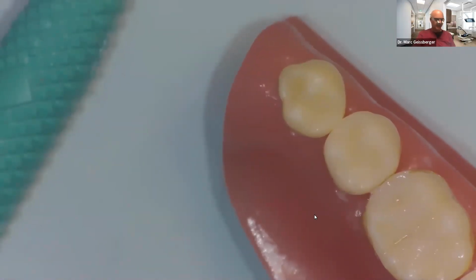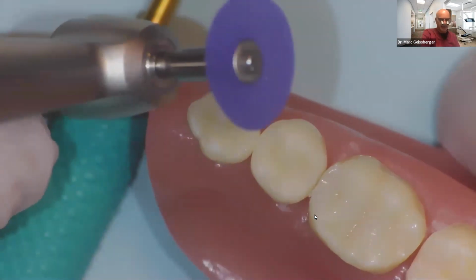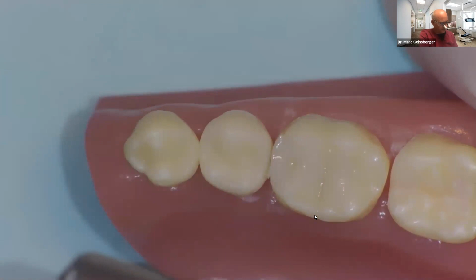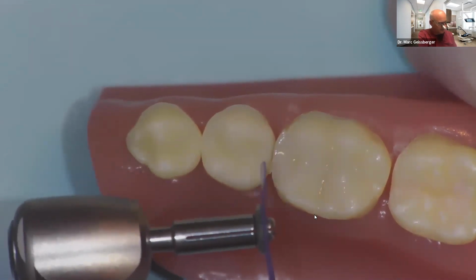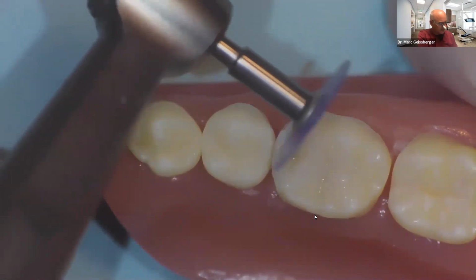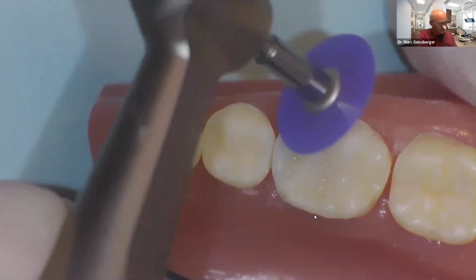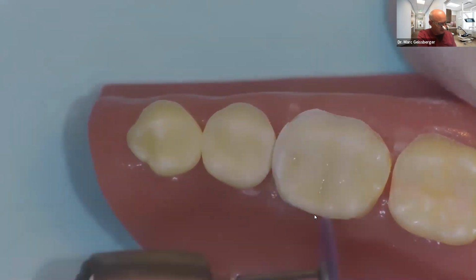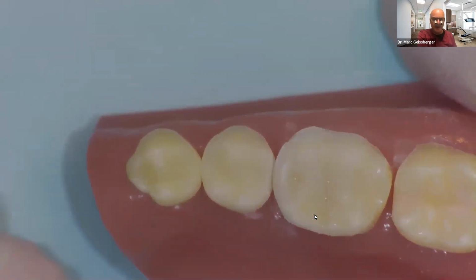We then adjust the occlusion and polish it. So I'm going to come in here, and I've got the disc facing away from me. So I'm going to come in here and very quickly, I just round this over. And I can come out to the facial and get that rounded.